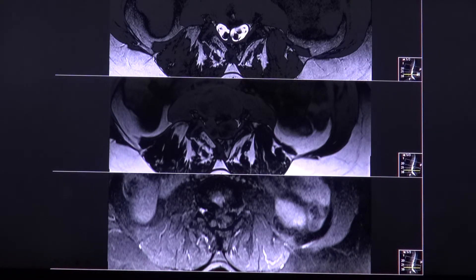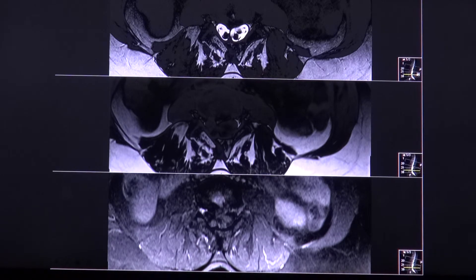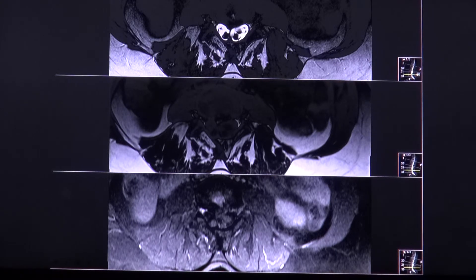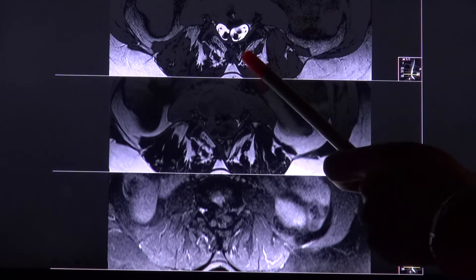In most cases both hemichords have their own central canal and one ventral and dorsal horn as well as nerve root. Mostly the hemichords unite above and below the cleft. The best imaging method is MRI, where you can identify both hemichords well, as seen in this case.